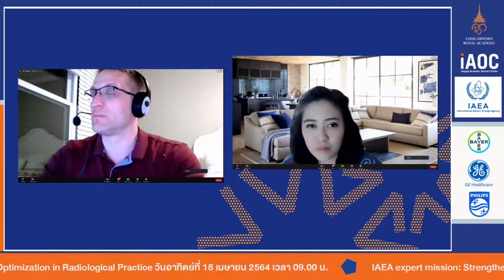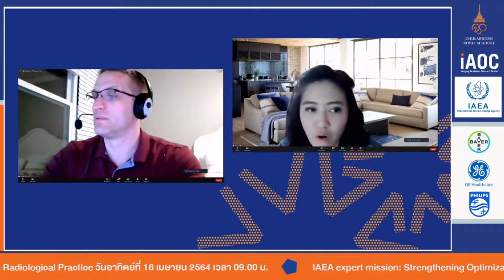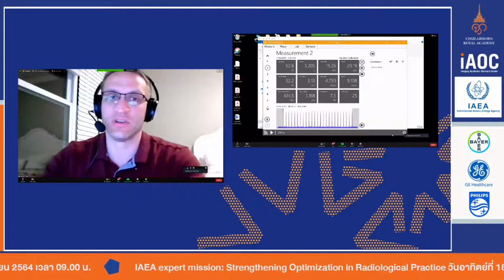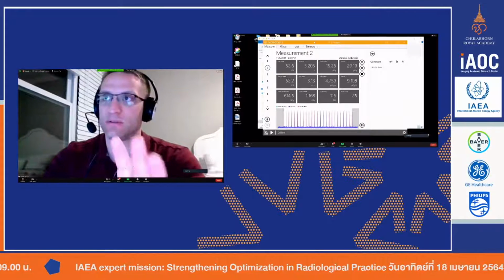Should it be like a default or a preset setting on those things for radiologists? Mm-hmm. Yeah, all of those things you can predefine on a system. Even if you've already bought the system, you can go in.